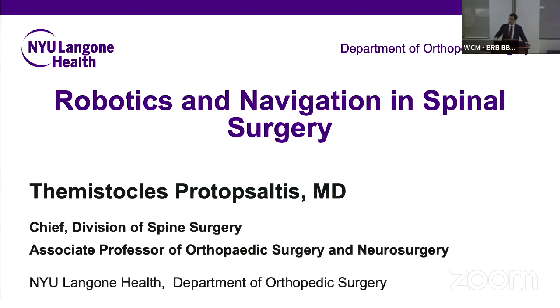I have not used a lot of 2D registration to match to preoperative imaging, so doing segmental registration. Although I know it's becoming ubiquitous, right? All the companies are having a system like this so that you don't have to get a repeat intraoperative navigation. Now, how good is this? I think it's probably good for bony anatomy, but disc spaces are going to change. A little bit of rotation is going to change. If you're doing osteotomies or decompressions based on that, I think you have to be careful.